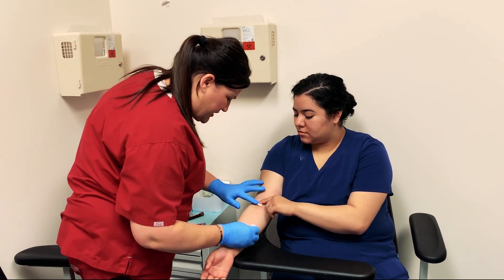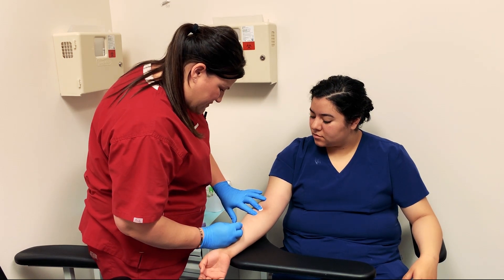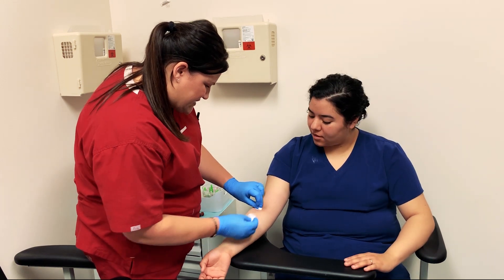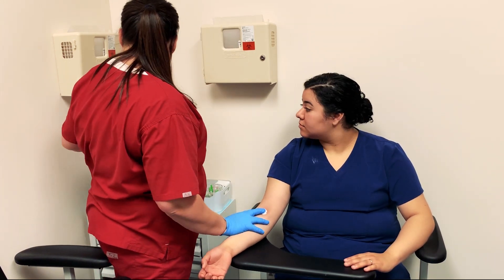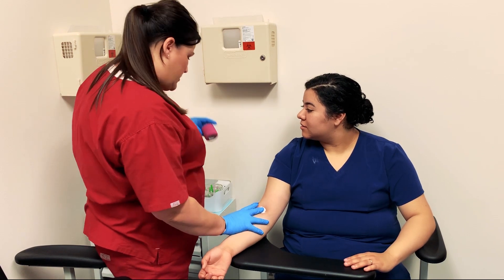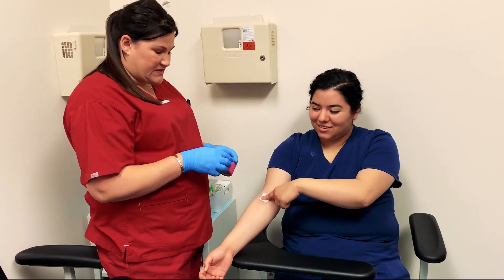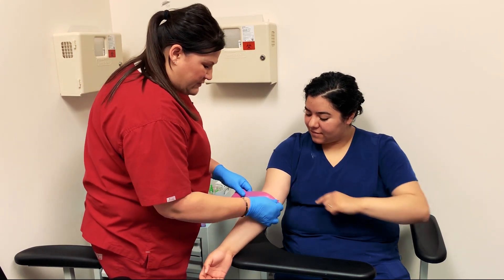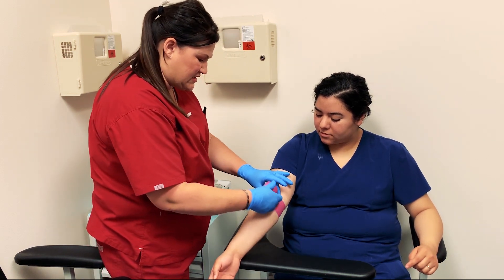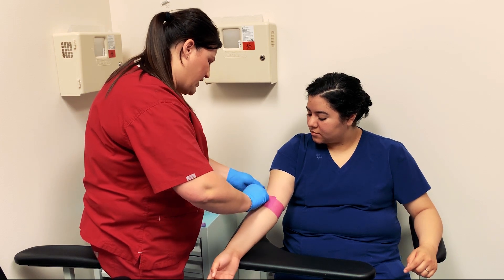Let me bandage her up really quick and then I'm going to show you how we're going to get this ready to go out for transport. Usually when a specimen has to be transported, a courier comes to pick it up, so we have to make sure that it is appropriately packaged so that it doesn't spill or break when the courier comes.